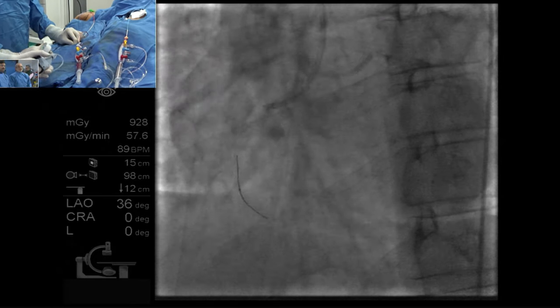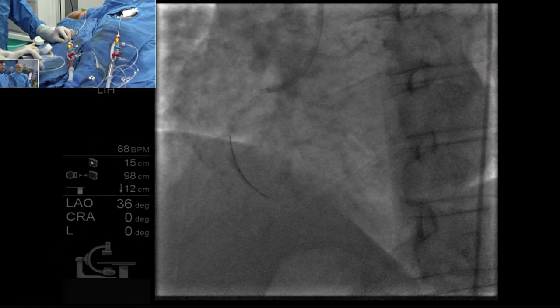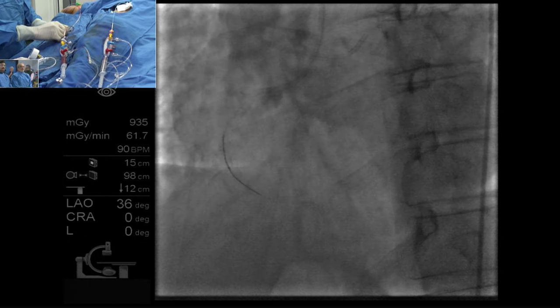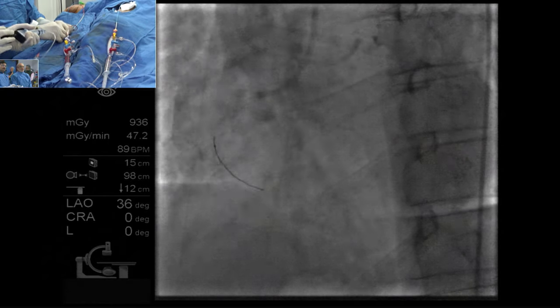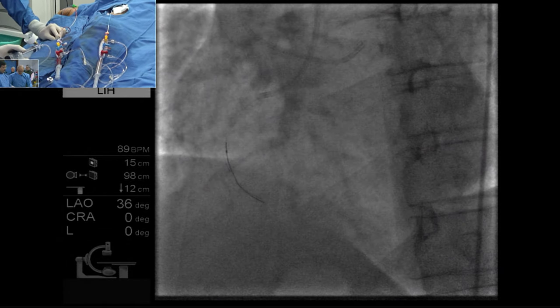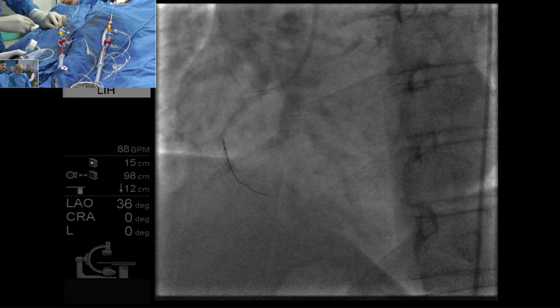In Japan, how would you have dealt with this? In this case, I think we sometimes use the Tornus. Tornus is similar. This one is Tazuna. What's the length of this? Length is 1.5 by 15. This is good work. Yes, it worked.